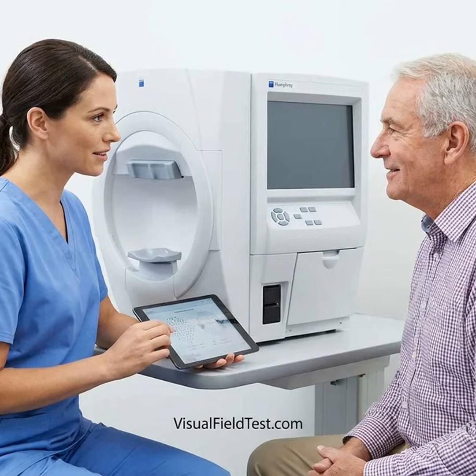Interactive demonstrations. An interactive demonstration can be more effective than spoken instructions alone because it allows the patient to see and rehearse the exact task. A useful demonstration may include a central fixation target, a simulated peripheral flash, a button response, examples of lights that are easy to see and lights that are barely visible, a brief example showing that the patient should not move the eyes toward the flash, and a demonstration of normal blinking and pausing.